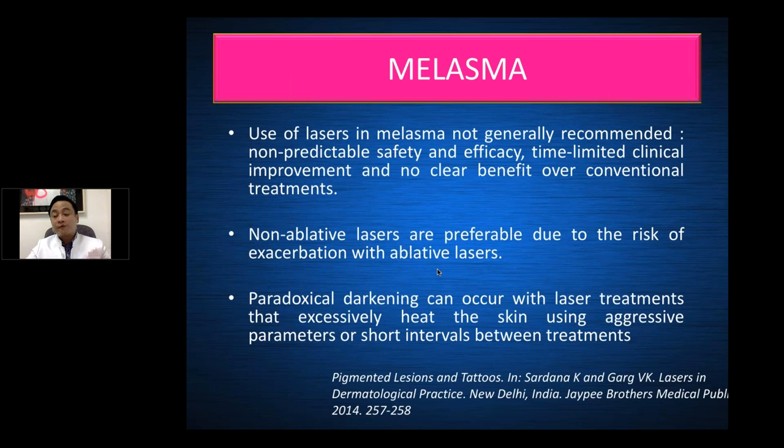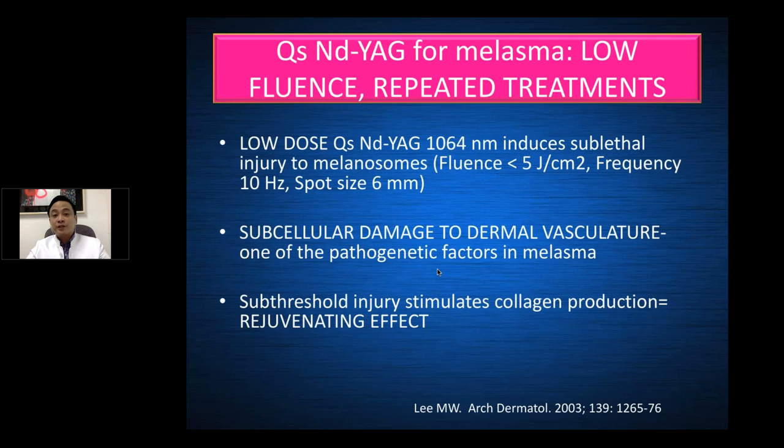However, a lot of studies are going on pigment lasers and their application on melasma. The non-ablative lasers are preferable because we have seen that if we do fractional lasers, there's often exacerbation of melasma. And of course, we have to tell our patients that a paradoxical darkening may occur after laser treatments. So what's new? Most laser experts recommend low fluence and repeated treatments.